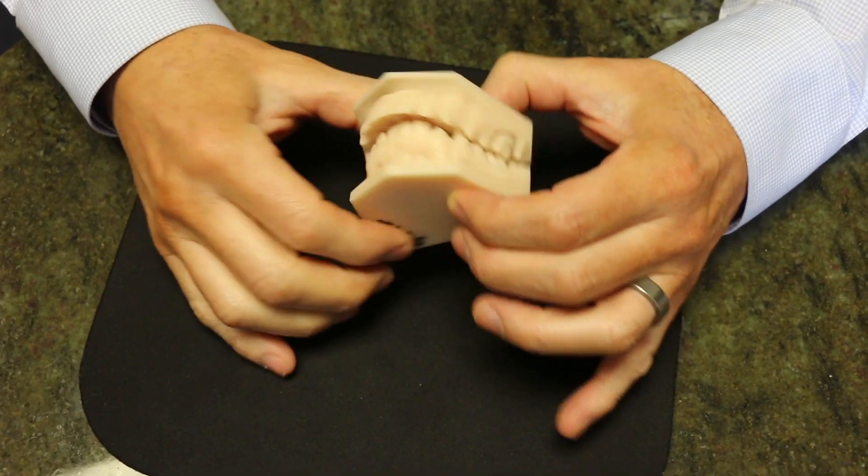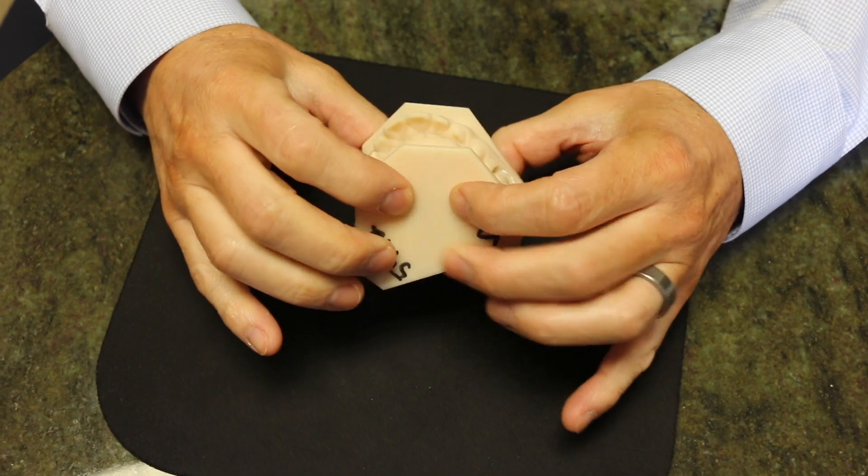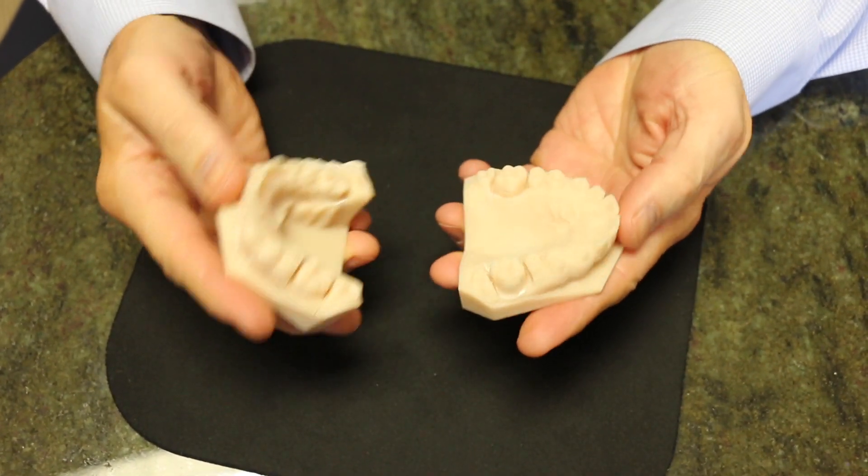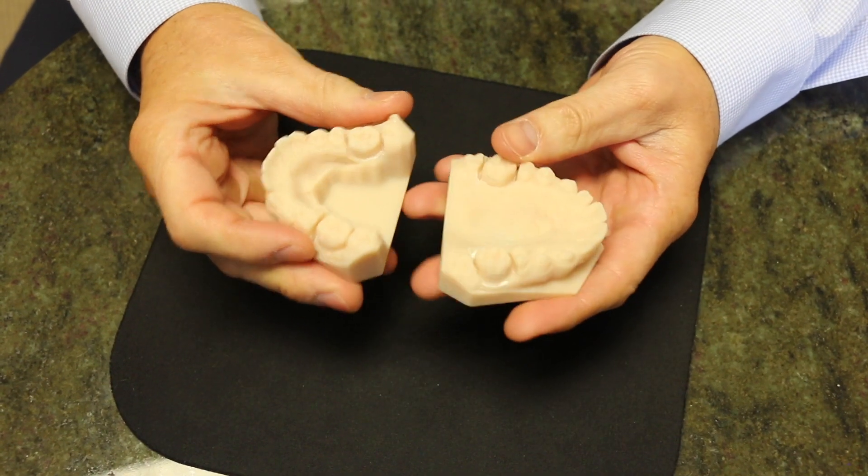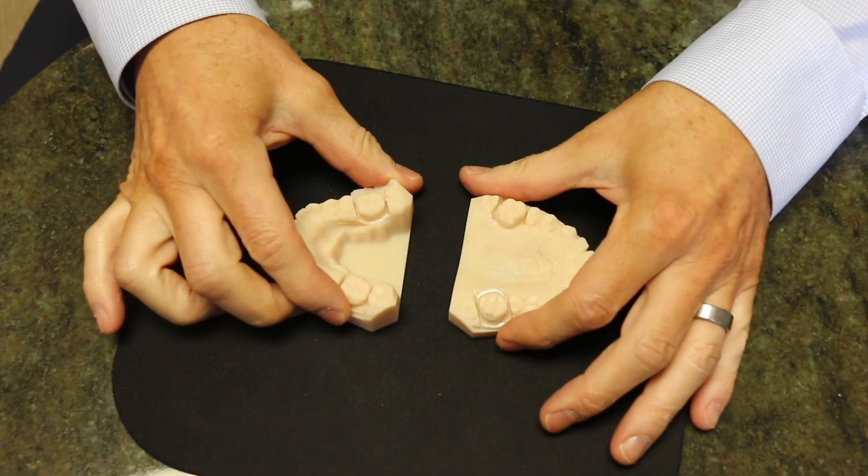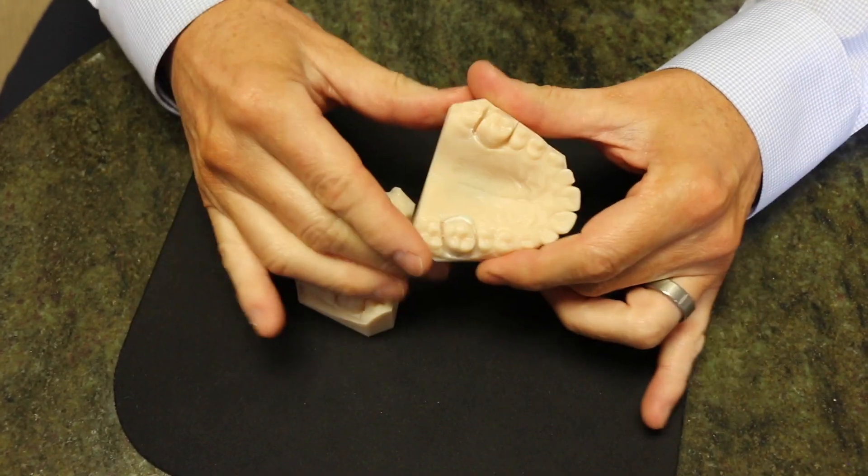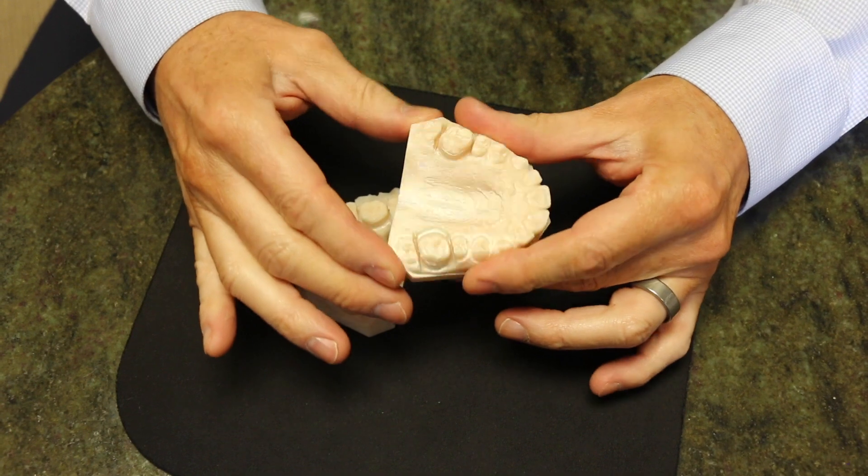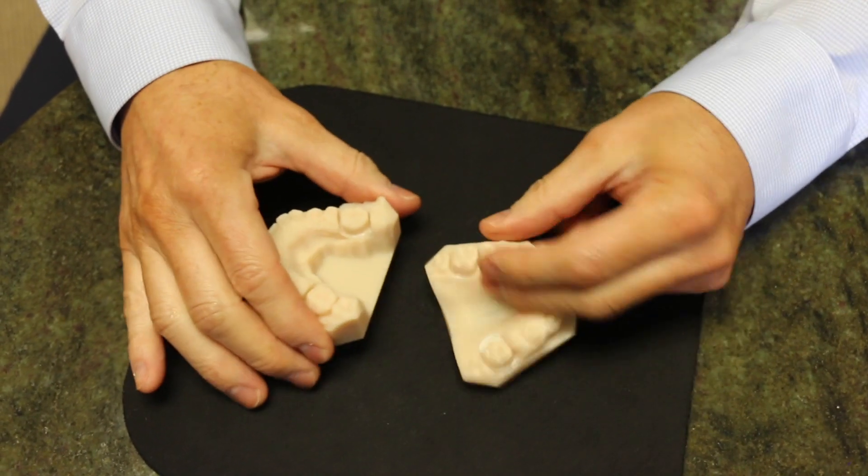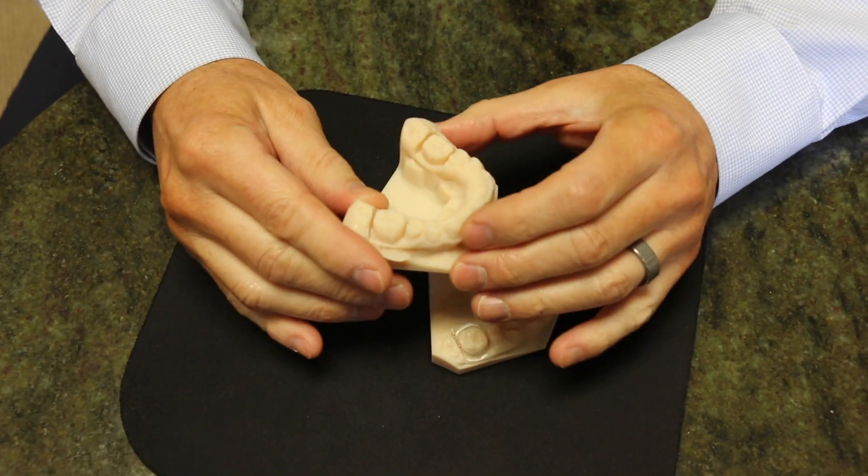Okay, so here we have a set of plastic models that were printed from a scan that we use in my practice. We actually don't take many molds of people's teeth anymore. We use a three-dimensional scanner and then we send the image to a company. They print the models using a 3D printer and then they send them back to us with whatever appliance we need manufactured.